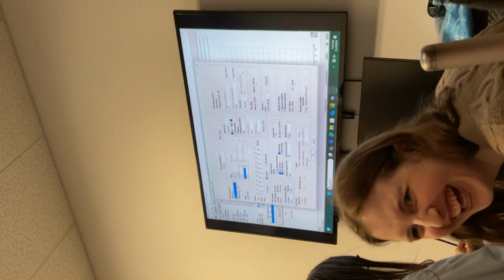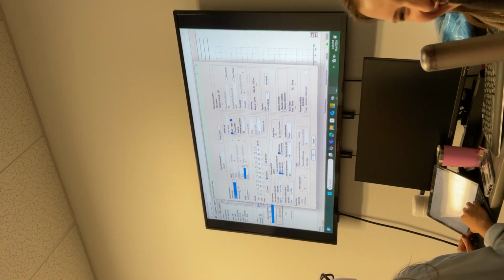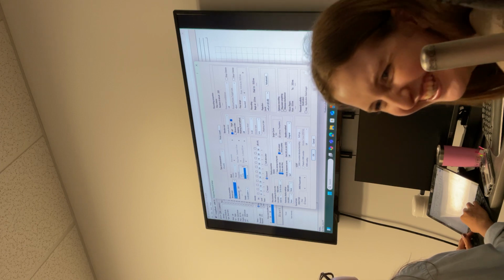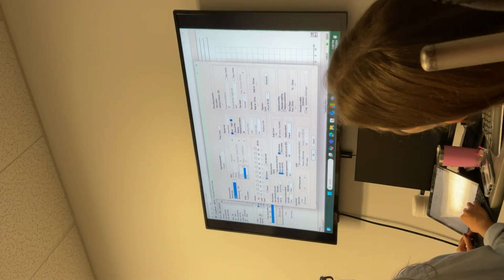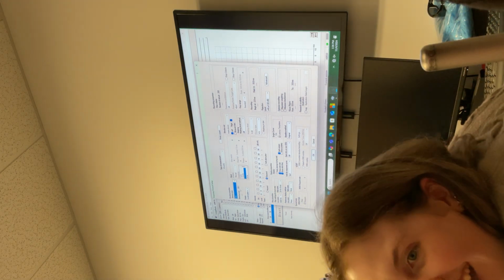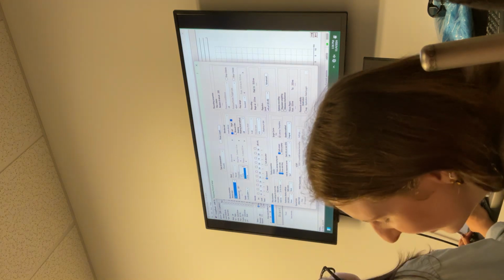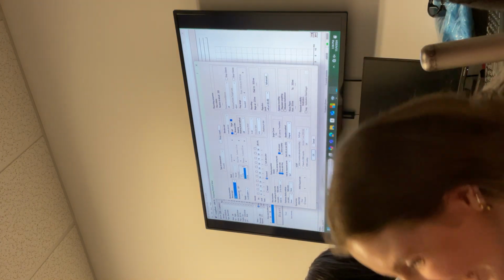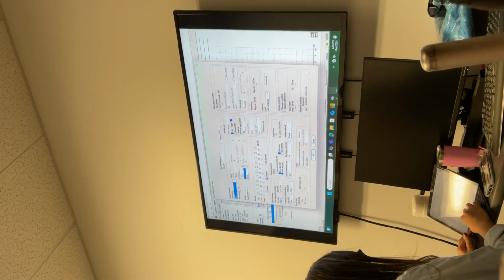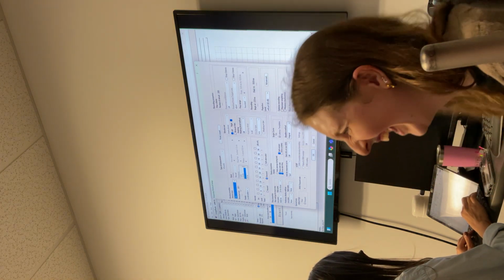What do you see with the click? I can't see that far, Dr. Stone. Somebody ask your friends to help you. Okay, friends, help. What was the question? It says click. What do you expect to see with the click? When you play a click, how does a click waveform look? Pretty robust, it's going up and down. Yeah.